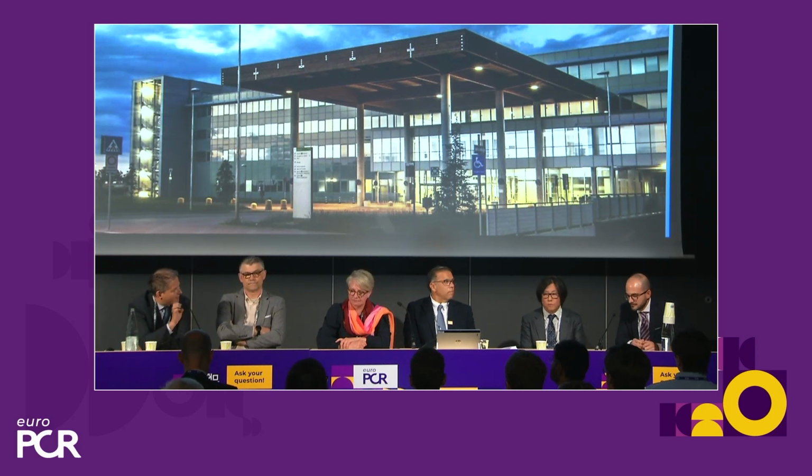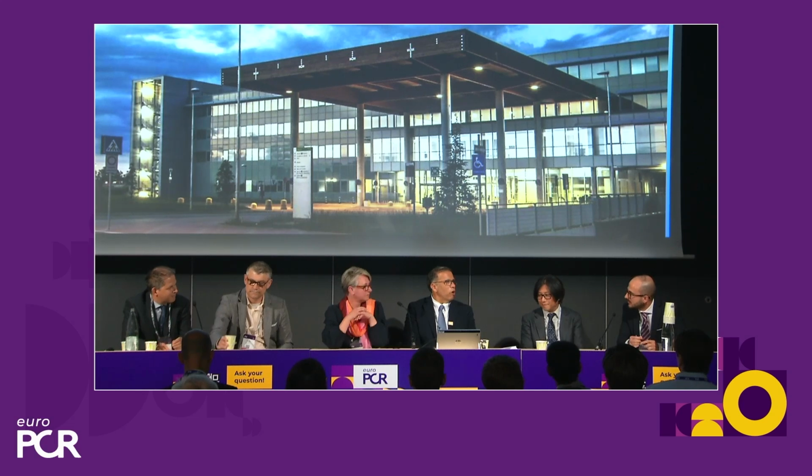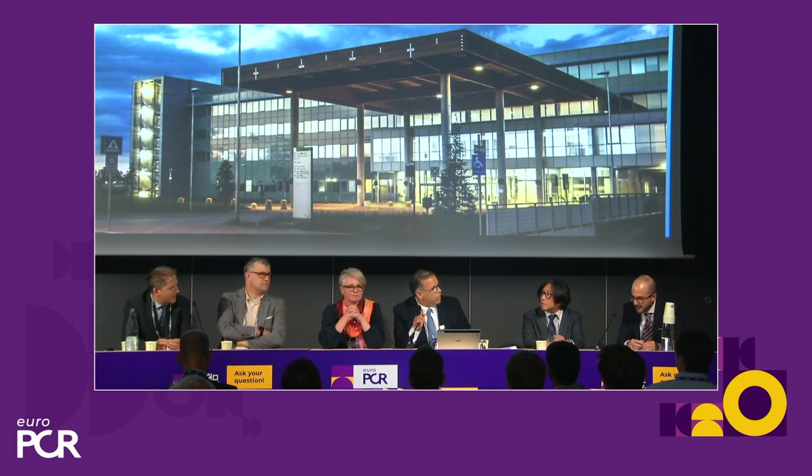Do you think that could be a red alert to repeat or not, since changes occur like in FFR, or is it more stable, more reliable? We already have evidence that the QFR performed with the angio acquired during the primary PCI is completely comparable to the follow-up. So we don't perform another analysis during the staged PCI. That's a big difference with invasive physiology. Yeah, invasive physiology changes in the next procedure.